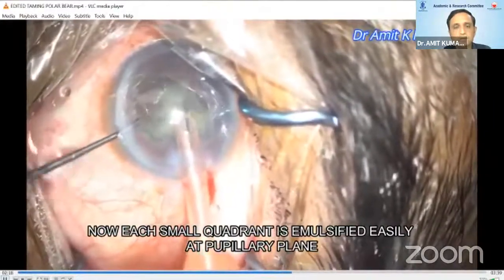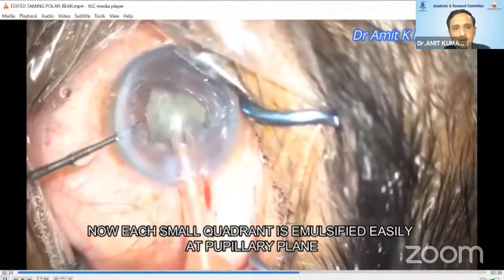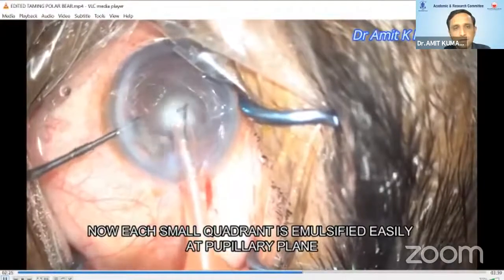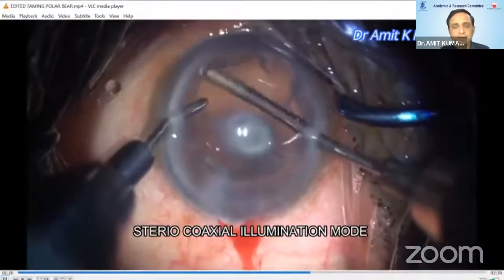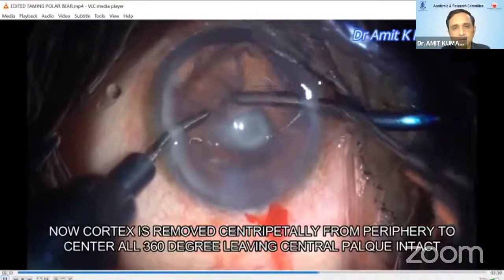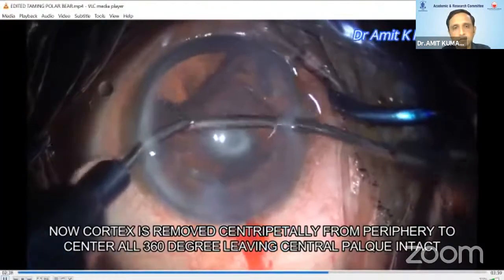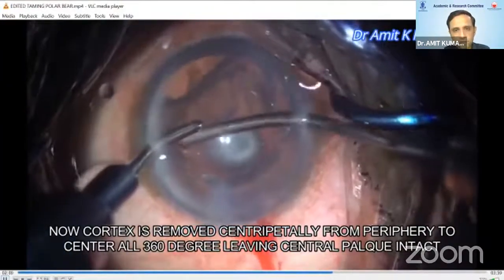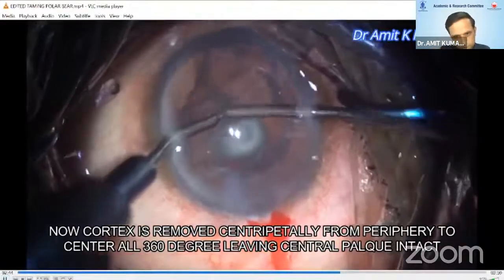After easily emulsifying these four pieces, you are left with a thick epinuclear sheet with cortex. Here, I always prefer bimanual over coaxial because it helps me in 360-degree removal. The tip is to position your aspiration cannula exactly below the anterior capsule rim.